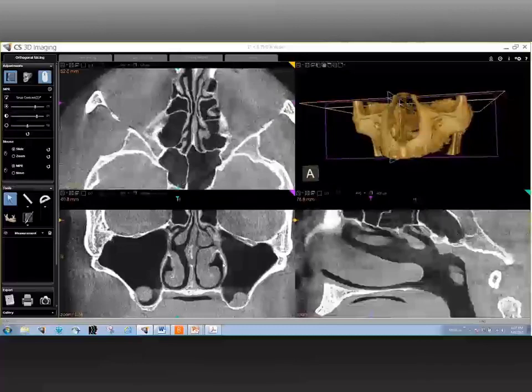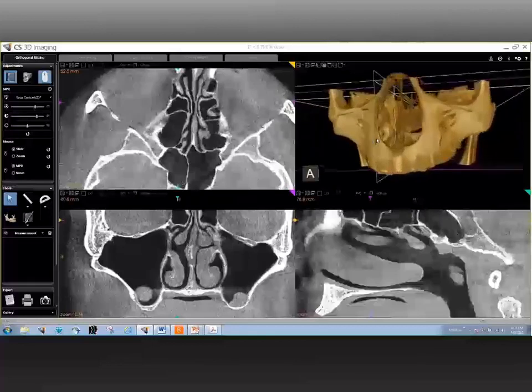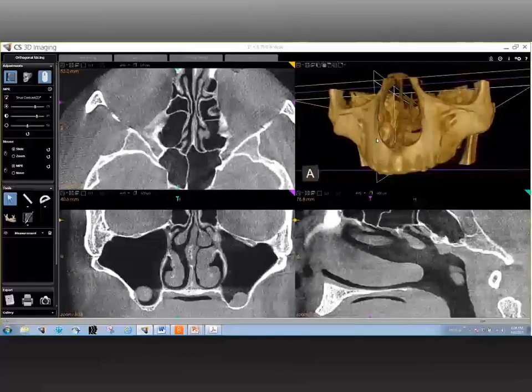For caries diagnosis, the traditional intraoral methods probably hold the best. Use your best receptor. Your bitewings, your regular periapicals, those are all the modalities that you probably need to rely on for now when it comes to diagnosing caries.